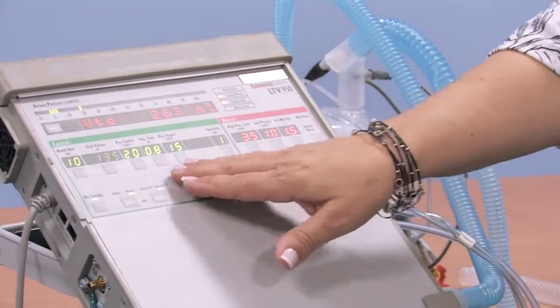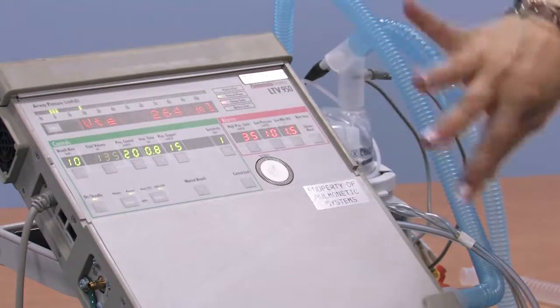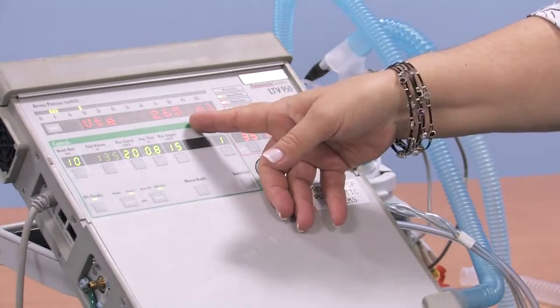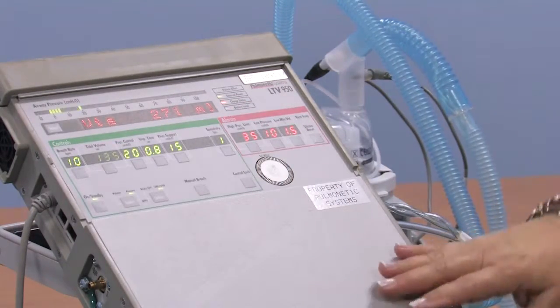When your child's in a pressure preset mode, the volume, as we showed you earlier, varies depending on how easy or difficult it is for them to let the air into their lungs, so you may wish to watch the tidal volume to see that they're getting the volumes that you're familiar with, that you're used to.